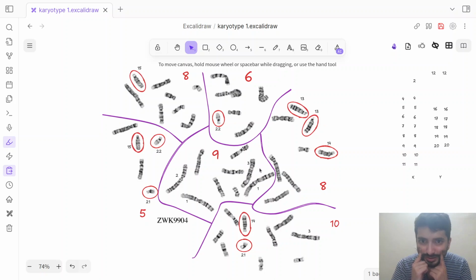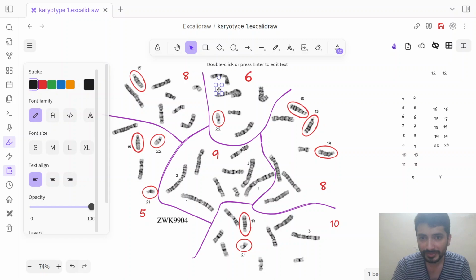Are you able to find it? Oh, so I think this one is actually folded a little, and that is why it appears very dysmorphic. But if you see closely, the banding pattern actually is quite uniform across both the arms, and the centromere appears to be not very densely staining. This is chromosome 2.